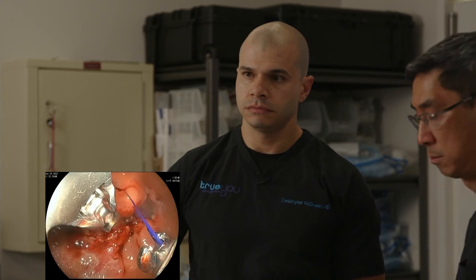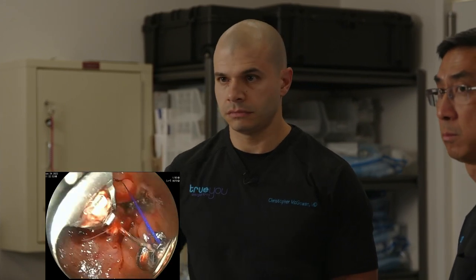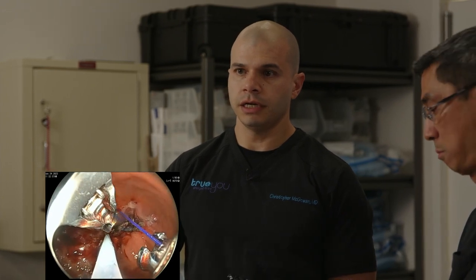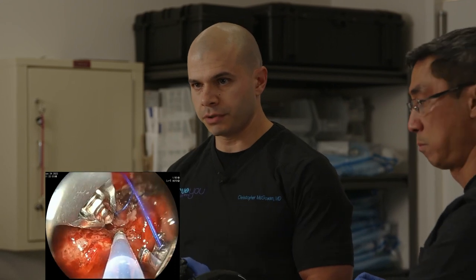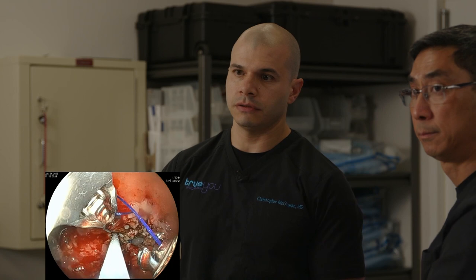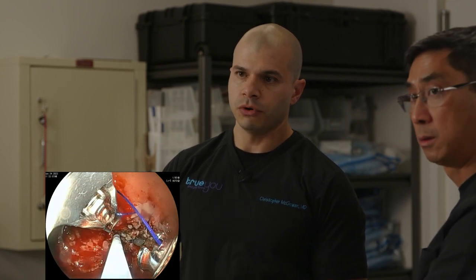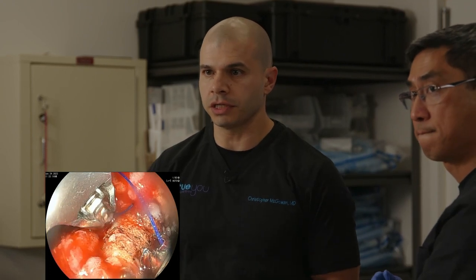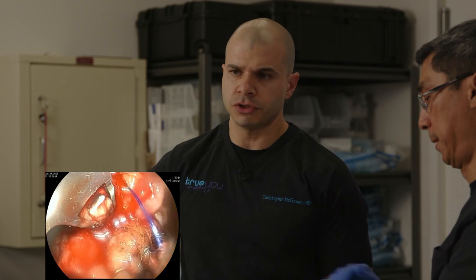Leonard from YouTube again. Can this procedure be used to convert a sleeve to a gastric bypass? This could not convert a sleeve to a bypass. We do have a separate, somewhat related procedure to revise a gastric sleeve, which is more akin to the endoscopic sleeve gastroplasty. So we can endoscopically tighten a sleeve gastrectomy to make it smaller using the same suturing setup.